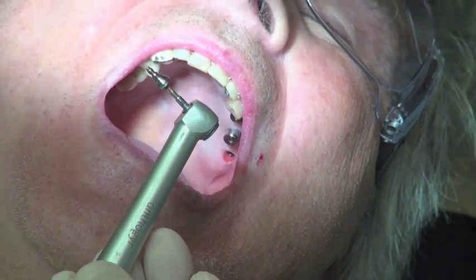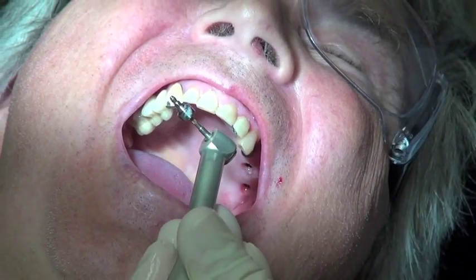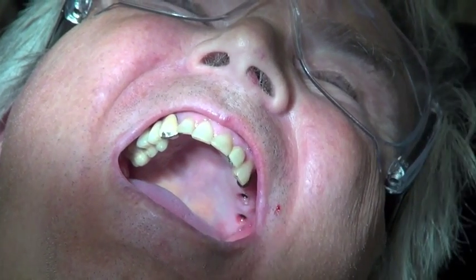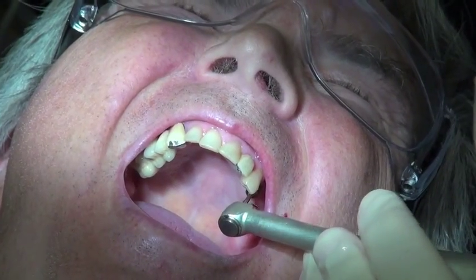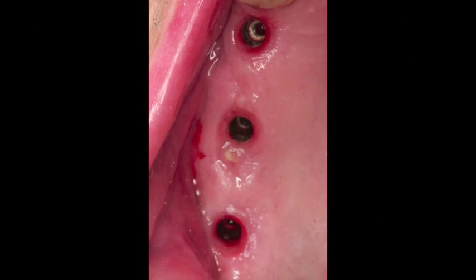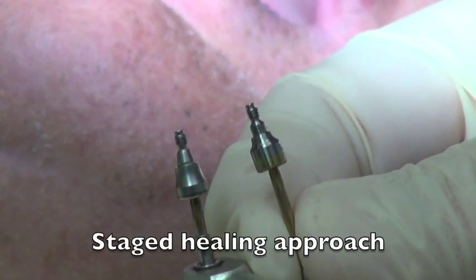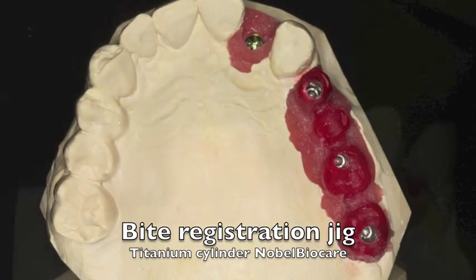I'll take the first one off, then go back in and take the second and third. I'm going to put these in some chlorhexidine rinse to have them soaking in the meantime. Here we're looking at the implants themselves — you can see they're healing quite well. I did use a staged healing approach with a platform-shifted healing abutment first, followed by a bridge abutment after everything had started healing.